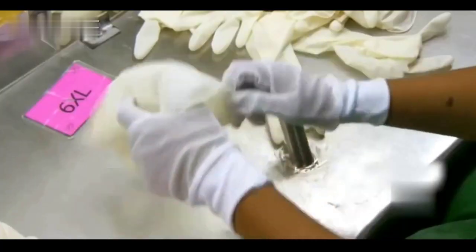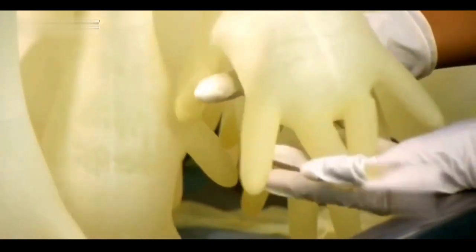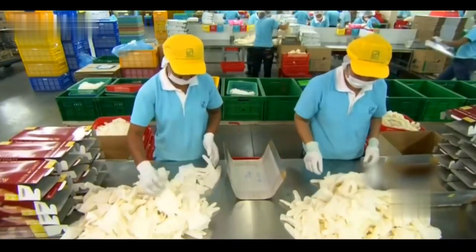The finished rubber gloves also need to be sampled for quality inspection. Quality inspectors use the methods of inflating, pulling, and injecting water to observe the gloves respectively, detecting whether there are holes and water leakage.